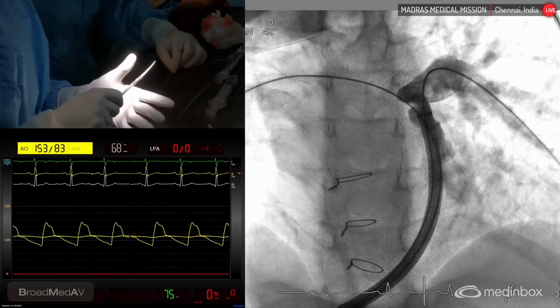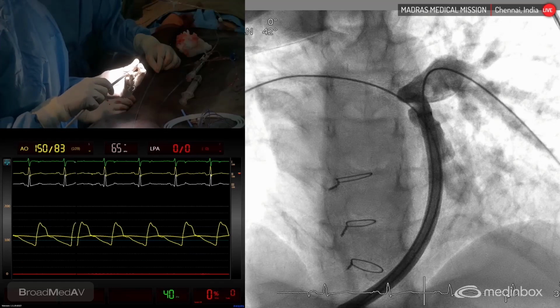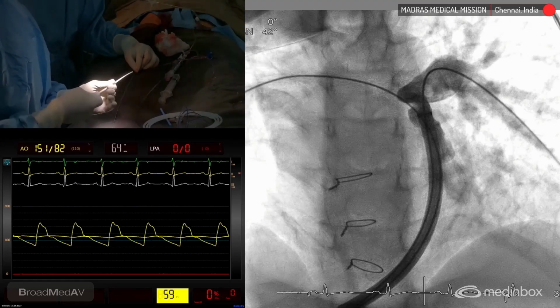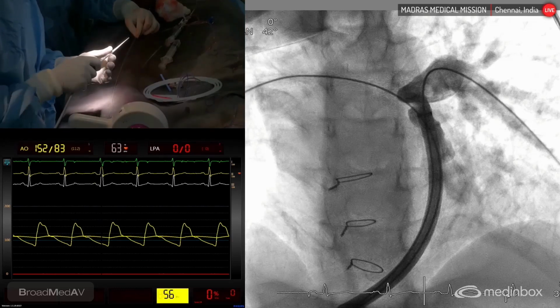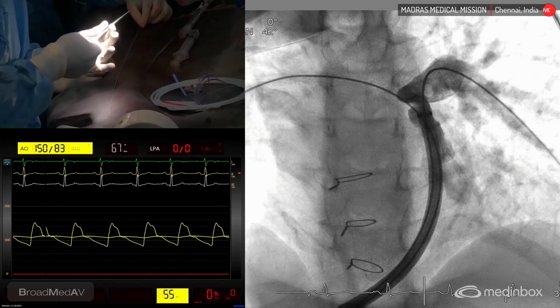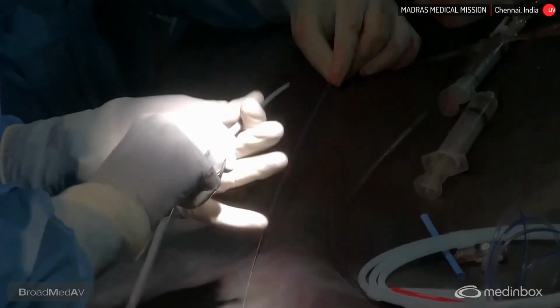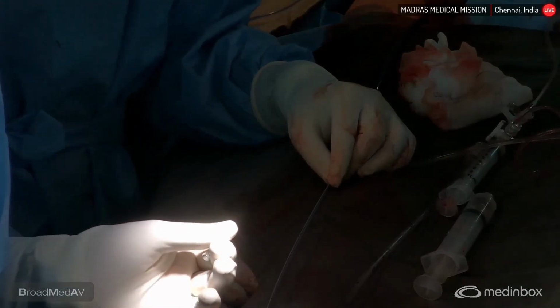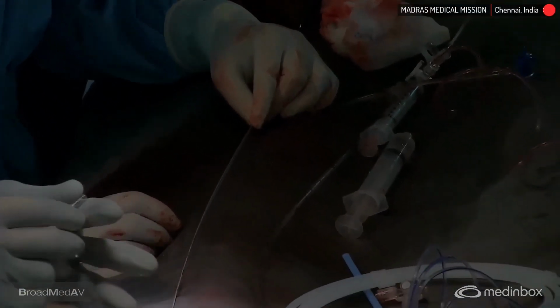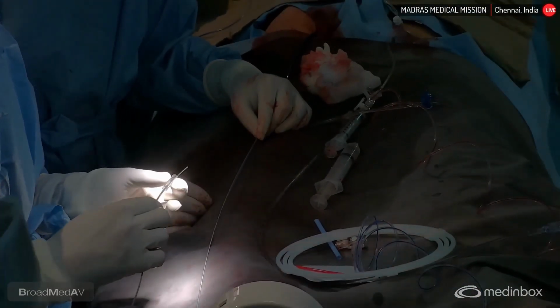So we are doing what is called a double balloon single stent strategy. Okay, get another wire, 3-5 wire also through the other one.